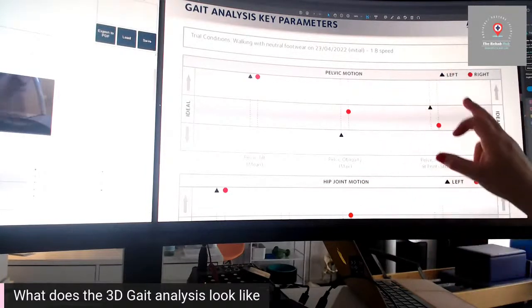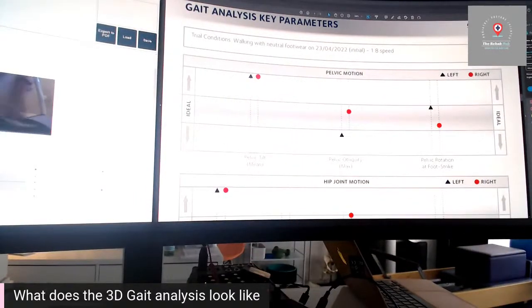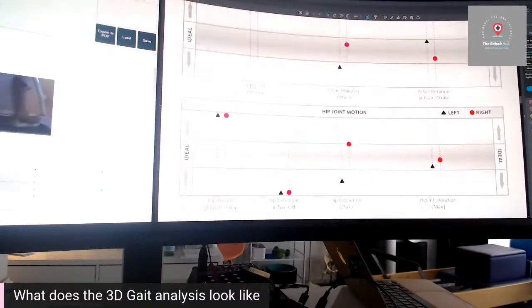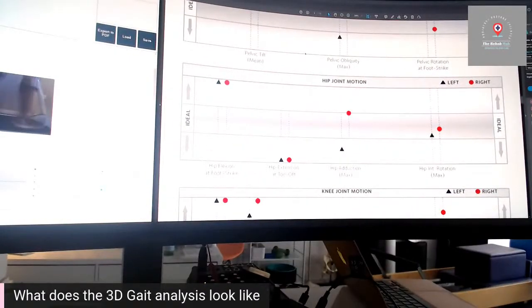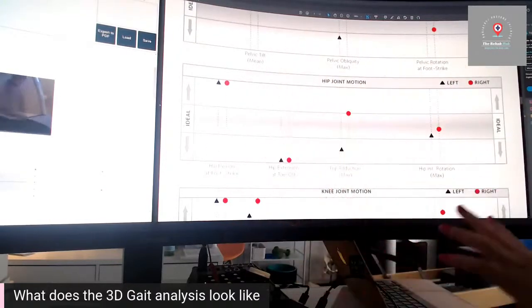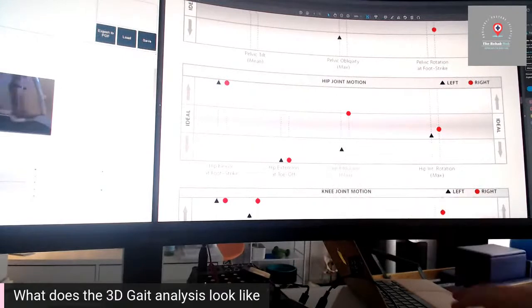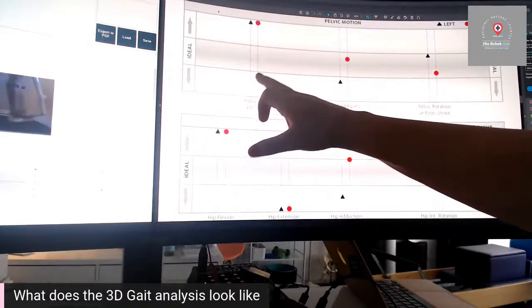So that's really where the eyes are drawn to, but we also need to take into account that there's this very high anterior pelvic tilt, which will usually indicate a very low hip extension, which I know in this particular patient, hip extension, look at that, it's down at the bottom, it can't get any further. So there's clearly some stuff going on with the hips with that particular patient. This particular patient actually came in with lower back pain. This isn't an unusual presentation given that. So we can see immediately the issues aren't just at the lower back. We can see right about that hip is where we need to focus our attention. We know the lower back, how it's sitting when that particular patient is moving, what it's doing.